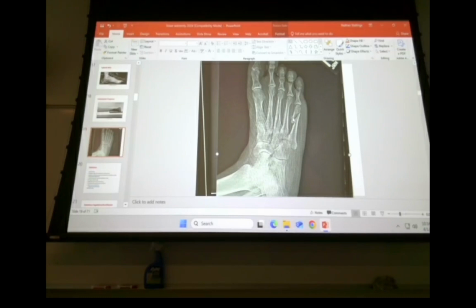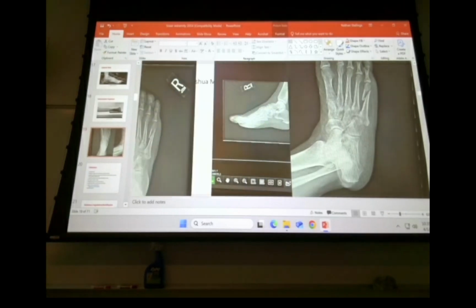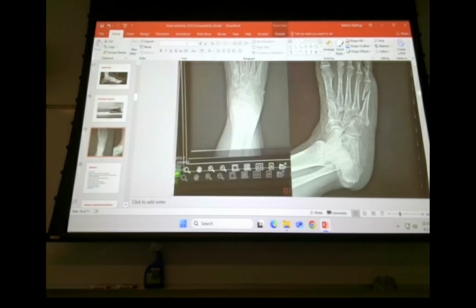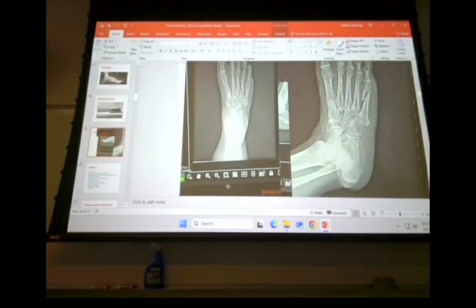If you have a good rapport with your ER docs, and they know that you know what you're doing, then you might shoot that and then go back and tell them to readjust the order to a 3 view. Or if you don't have that rapport with them, then you might show them the AP and say, you don't really see that on the lateral. Do you want me to shoot an oblique? So communication's key. Over time, they probably will get to the point where they will just say, if you see something, just go ahead and shoot it, and we'll adjust the orders.